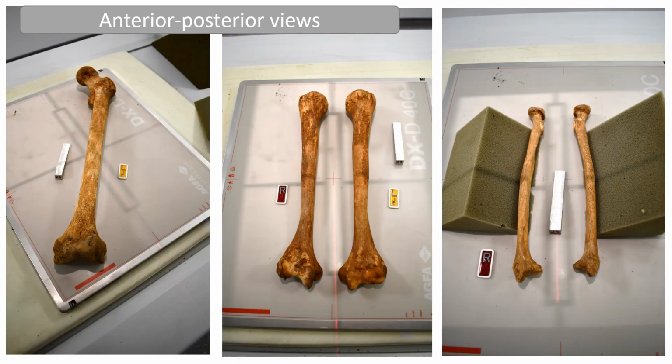And here are some examples of the bones being placed in an anterior posterior view, the femur on the left, the humeri in the middle, and the radii on the right hand side. In most cases, a sponge was not needed to obtain an accurate radiographic view.